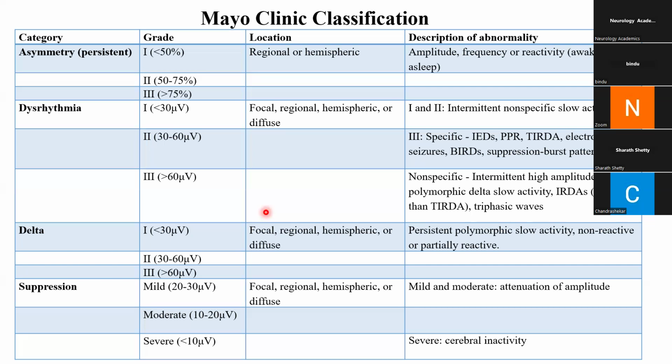So the technologist, what is the electrophysiology behind the salt bridge? Not what I described. What is common mode rejection? Who's the pioneer? Yes, Lubina. I was talking about common mode rejection only. What is that? Common mode rejection. You also, senior residents can also tell, any one of you? Yes, Rohit.